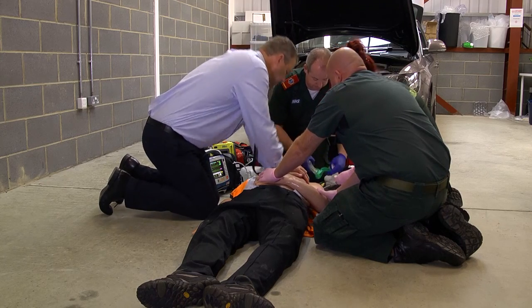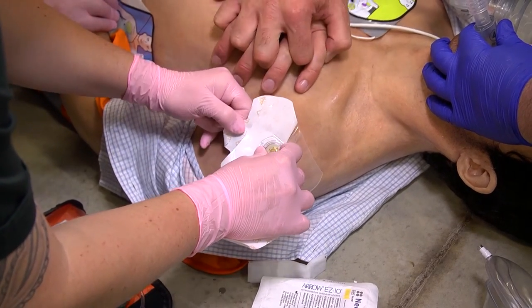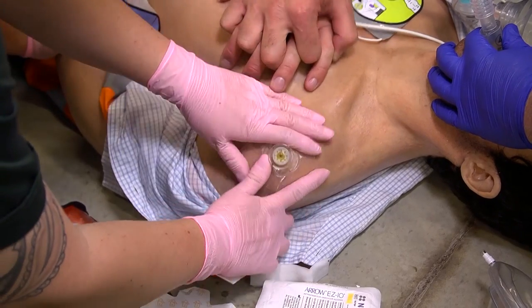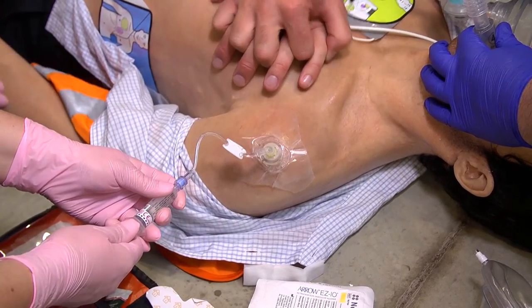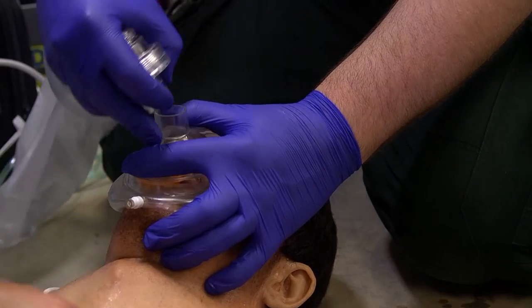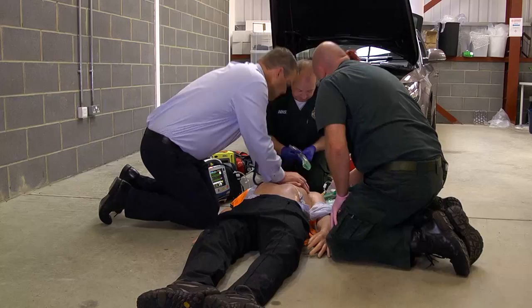16, 17, 18, 20, 24, 25, 30 seconds for the next rhythm check. Thank you. Andy, if you're finished around there, could you sort me out some capnography, please? Yes, certainly. Lovely, excellent. And let's get this swapped over for an i-gel. So just keep going, Jamie. That's brilliant.